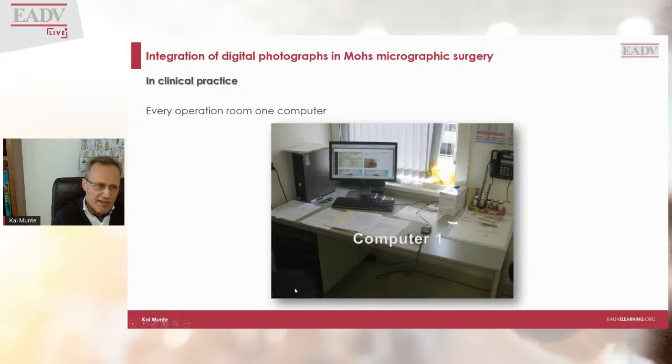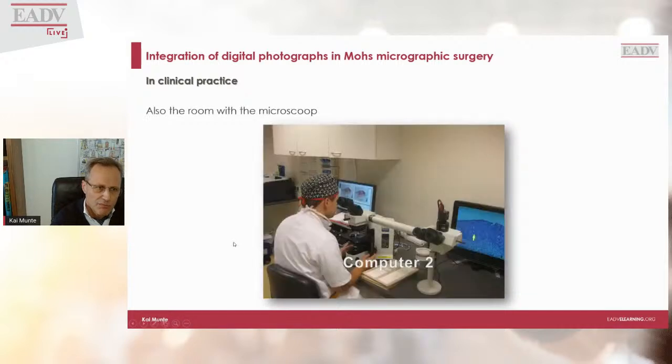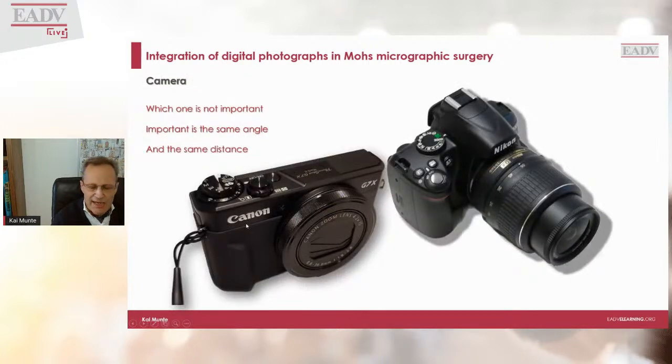Of course, you need a computer in every operation room, and you need also a computer in the microscope room. Which camera you use is not important. Important is that you try to take the pictures at the same angle and at the same distance every time.